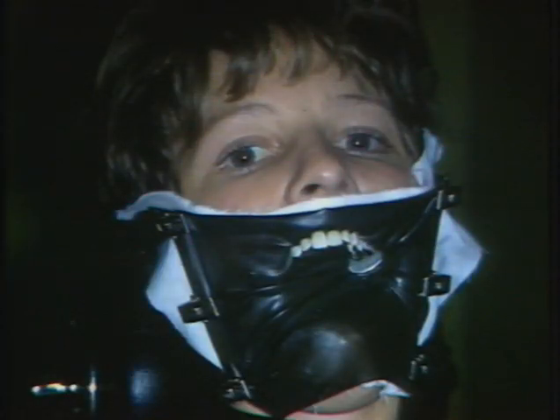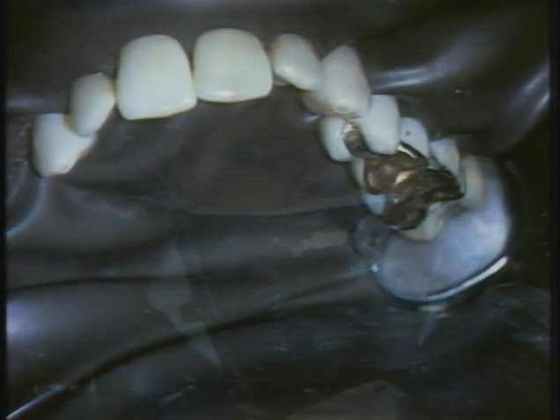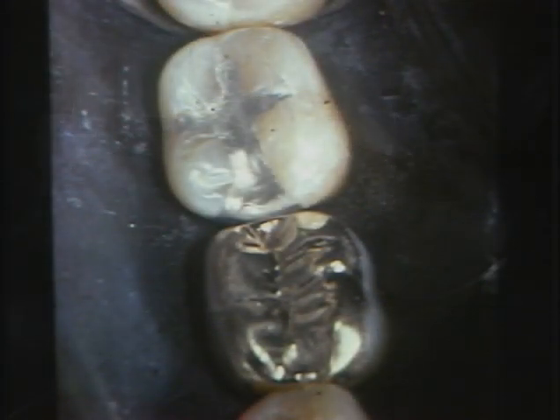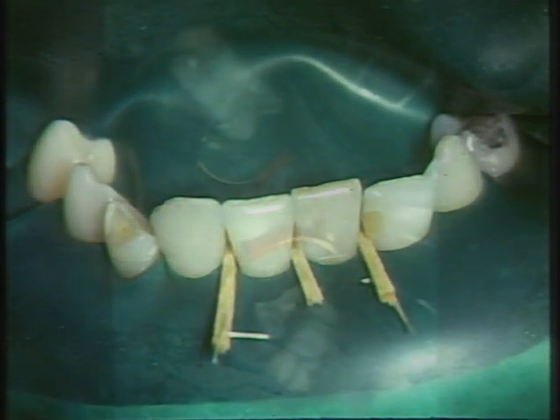It is advantageous to use the rubber dam for most cavity preparations and restorations. With the rubber dam in place, there is complete control over the cheeks, lips, tongue and gingiva, thereby enhancing visibility and access, especially when working at the back of the mouth or near the gingival tissue. We'll now look at the situation when the rubber dam is not being used.